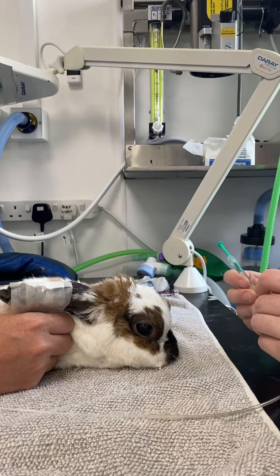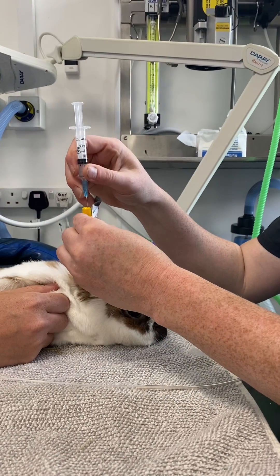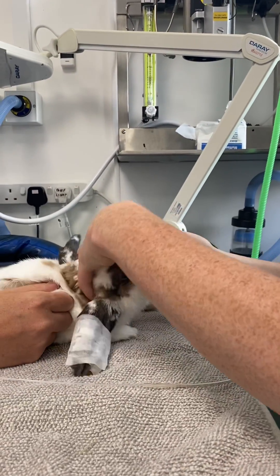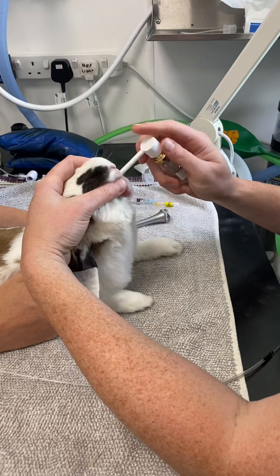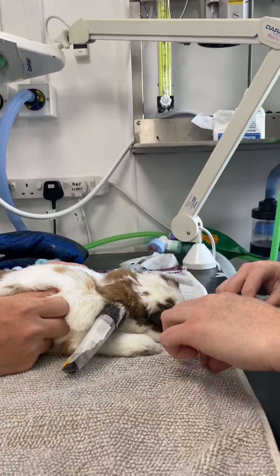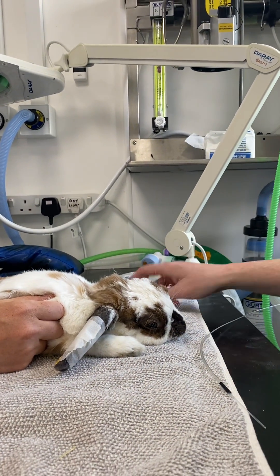We're inducing anesthesia in our sedated rabbit using alfaxalone — just tiny amounts, so that was a 0.05 ml bolus, then a little flush. The first thing we want to do while sedating the patient is pop a little bit of Intubeaze down the back of the mouth and let that work. Our nurse, whilst we're intubating, is going to be paying close attention, watching the breathing and listening to the heart.